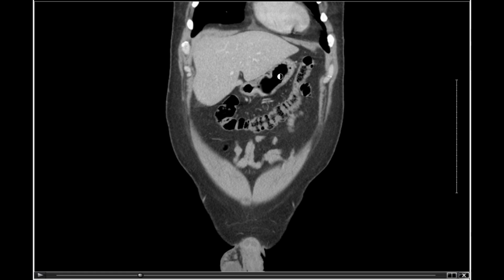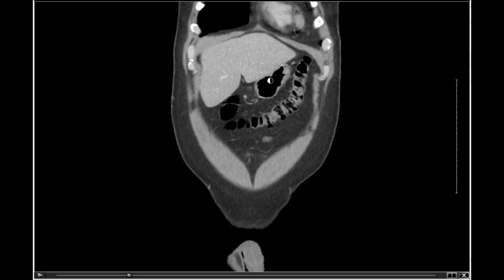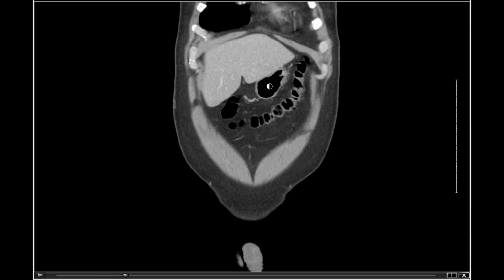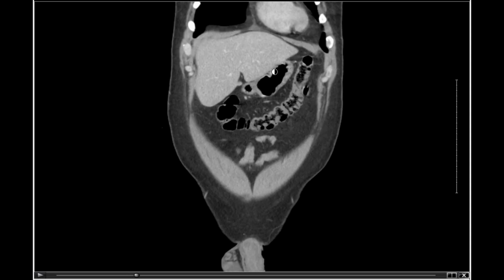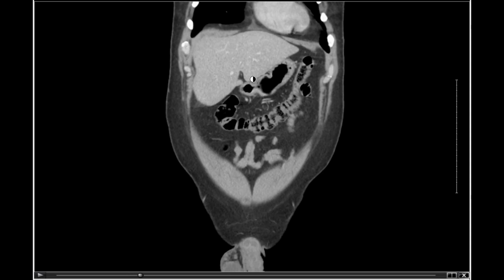So here's the liver and the stomach. So notice the stomach's a nice big structure here. It's pretty anterior, at least, because it shows up right away as we move from anterior to posterior. And going further in, you can see my pyloric sphincter right there. It's a nice view of the terminal end of my stomach becoming the first portion, the superior duodenum right there. And here, if we keep an eye over here, we're eventually going to see the esophagus traveling up that way. But we're not in that slice yet.